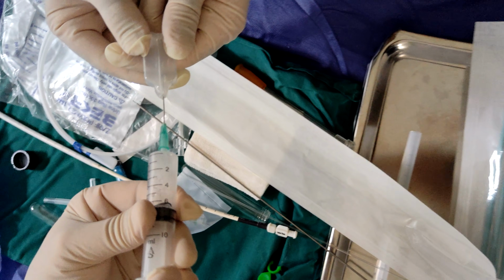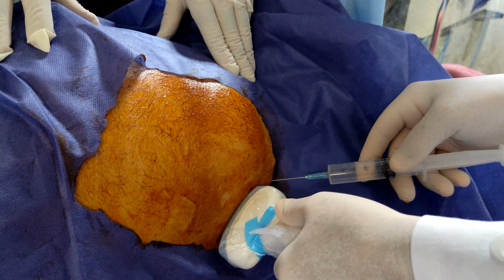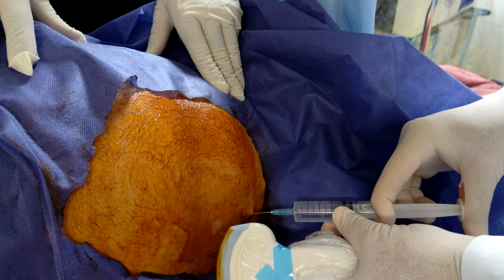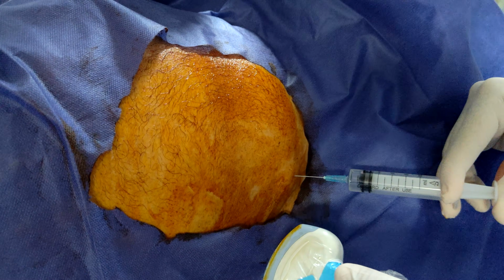After all this, the skin is cleaned with antiseptic solution and sterile drapes are applied. Adequate anesthesia should be performed to significantly improve patient tolerance and reduce movement during catheter placement.